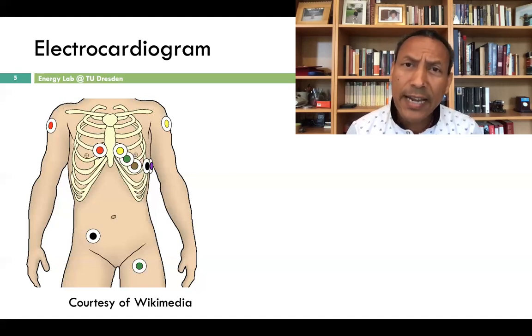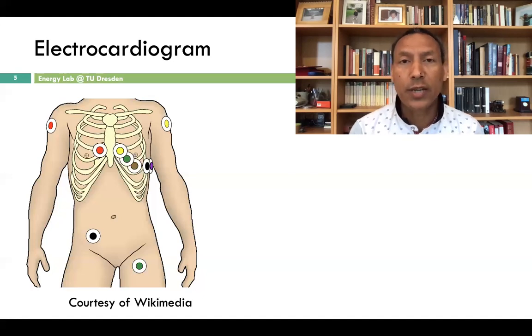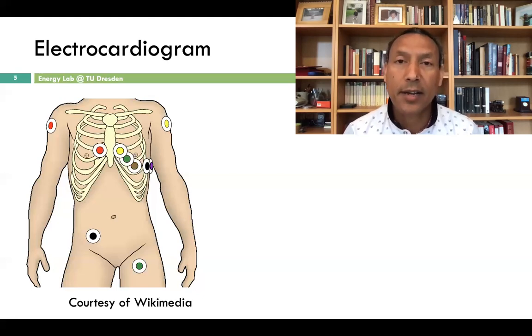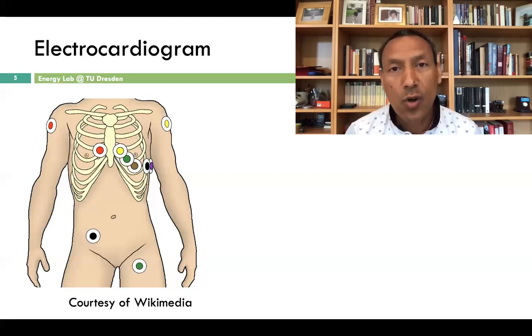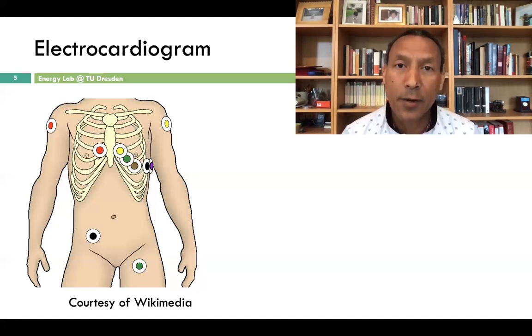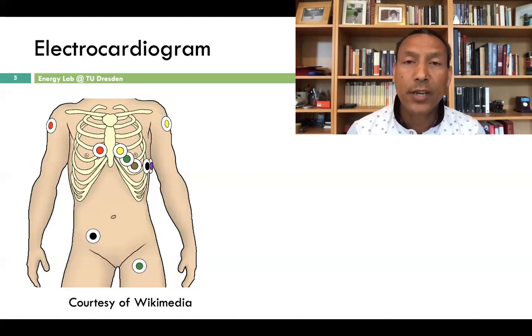There is a slight involuntary vibration or motion, and this motion disturbs the measurement of the underlying cardiac activity and introduces its own erroneous signal, which we represent as motion artifacts. Depending on the intensity of the movement, their intensity also varies.